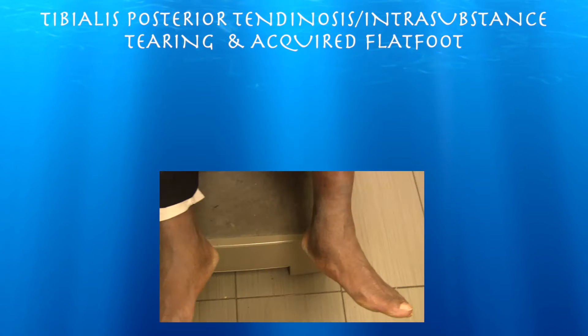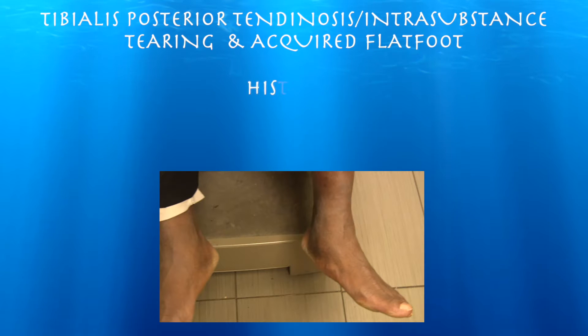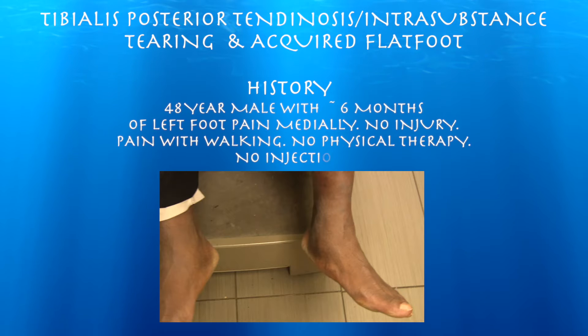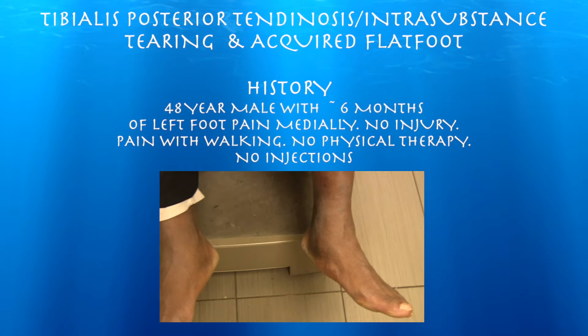This is a 48-year-old male with six months of pain in the left foot. There was no injury — pain with walking — no physical therapy, no injections.